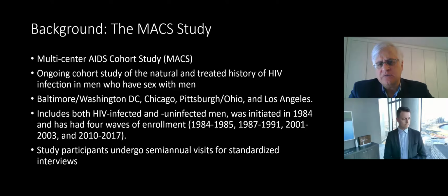The individuals at these different cities and sites were not sleep trained. In fact, none of them were. We were the only central sleep reading center, central sleep coordinating center, that provided very minimal, if any, education to the sites and the technicians, who again were not polysomnologists or respiratory therapists. They were research assistants that you would encounter in a clinical environment. So we were able to develop methods, which I will share with you, on how one can actually acquire sleep.